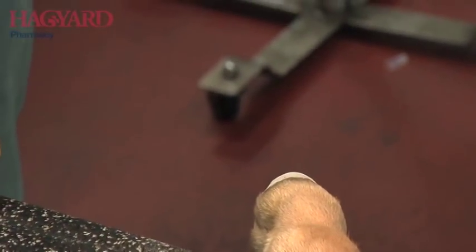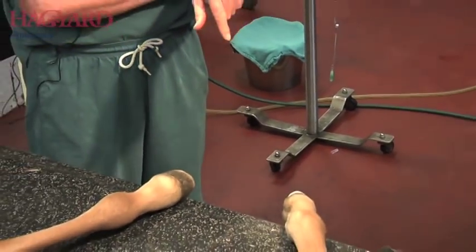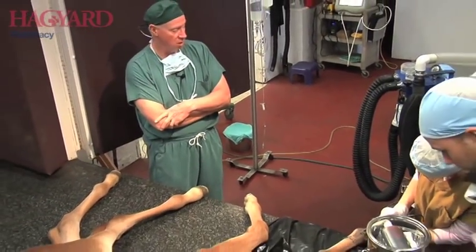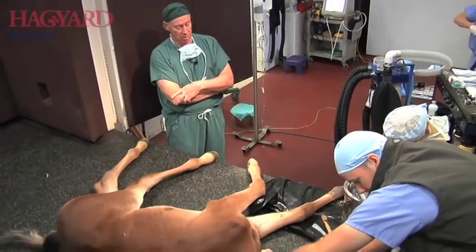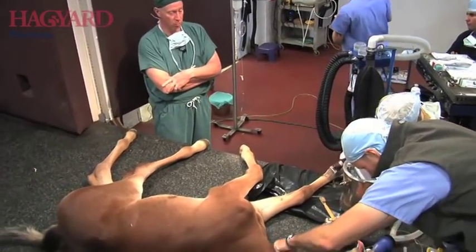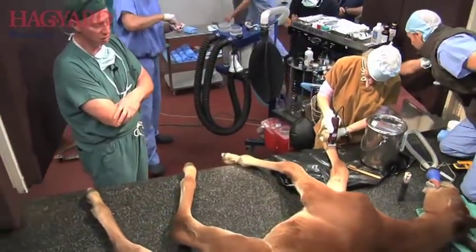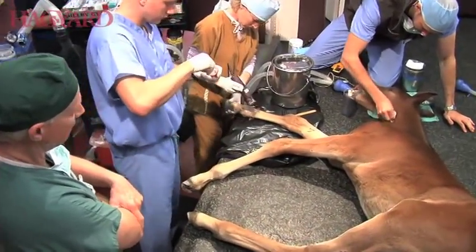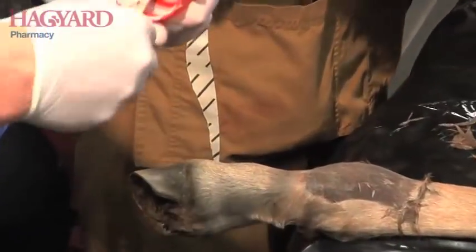At the same time, we're going to do a periosteal elevation on the inside of this fetlock. The periosteal elevation surgery is of some benefit, though not nearly as much benefit as a screw in the ankle would be. However, because this foal needs to ship out of state, the client has elected to only do a periosteal elevation and not put a transphyseal screw in the leg. So now this stuff is being mixed and will be applied to the foot.